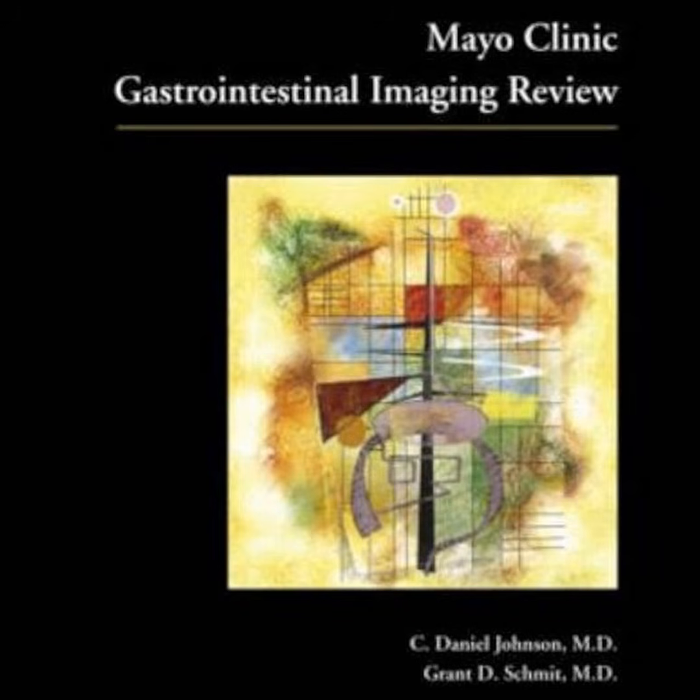Where the inflamed mesenteric fat physically wraps itself around the exterior of the diseased bowel. If you see those complications, fistulas, abscesses, creeping fat, you are dealing with Crohn's. And the text notes that magnetic resonance imaging, MRI, is actually the preferred modality here. Oh, absolutely. MRI provides far superior soft tissue contrast for mapping out those complex perianal fistulas compared to a standard CT.